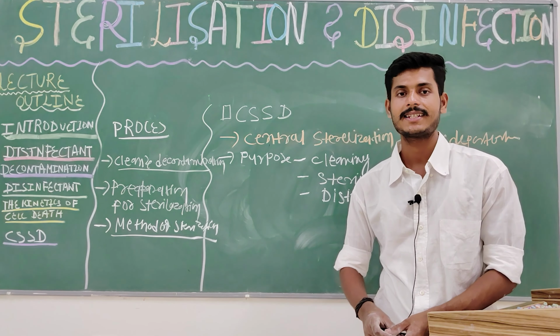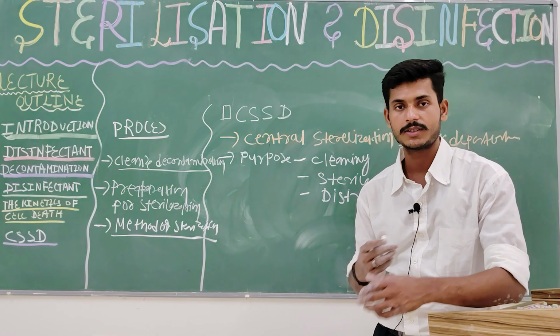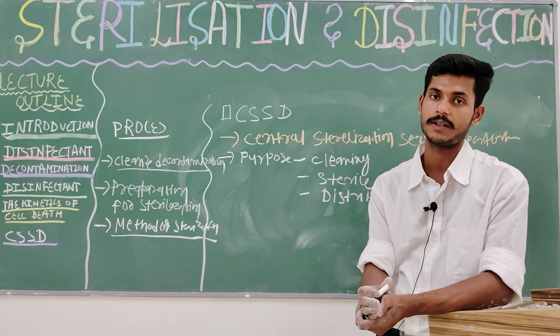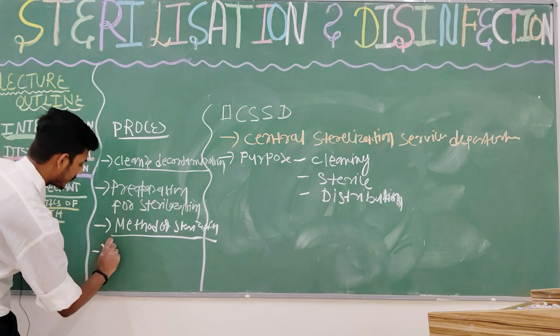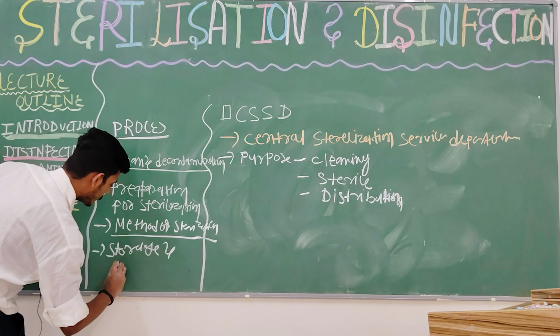After sterilizing the equipment, we do not generally use it immediately, so we have to store the clean equipment. So the next step is storage and distribution.